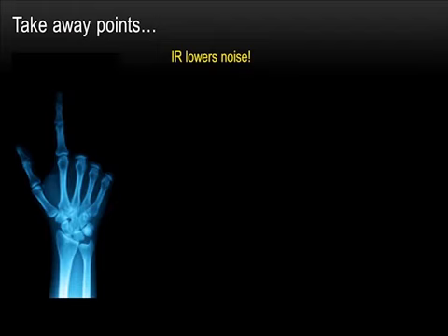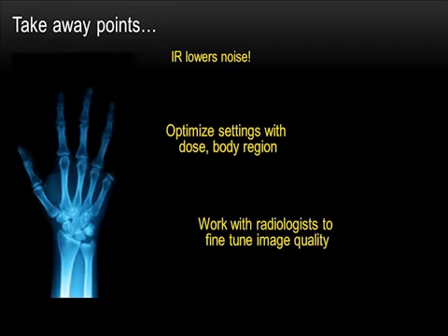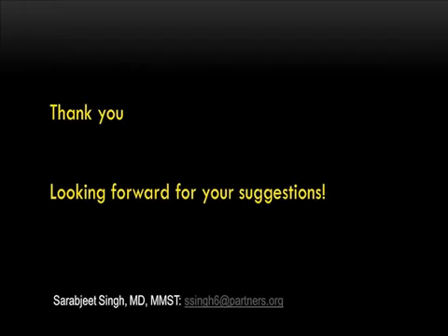So the 3 key messages over here are, first of all, IR lowers noise, but be careful with the visibility of smaller structures. Optimize your setting based on your present doses in the institute and the different body regions. And then finally, work with the radiologist to fine-tune your image quality. Thank you.